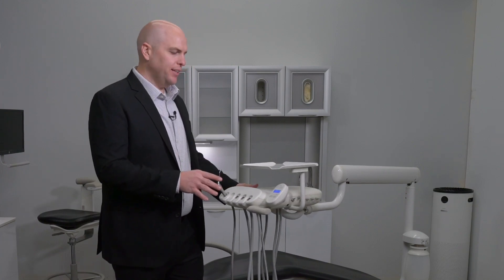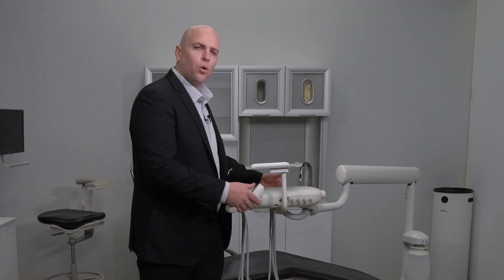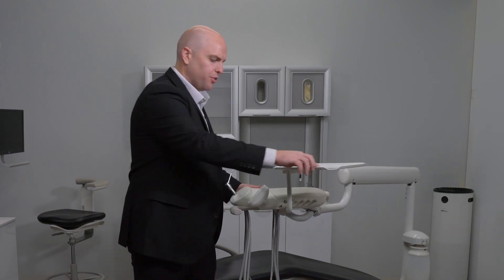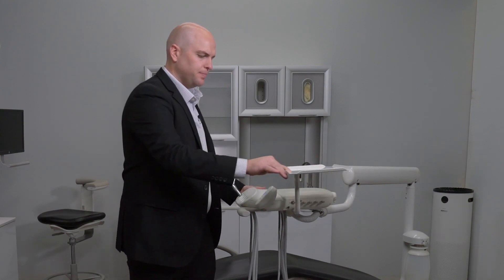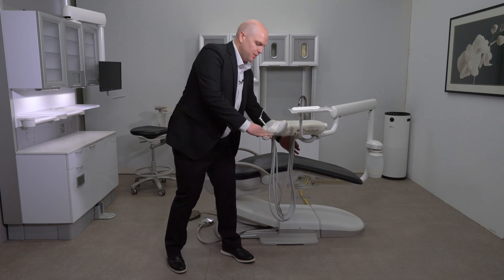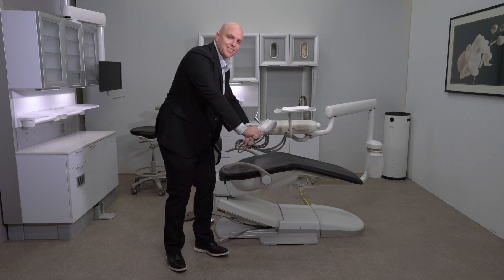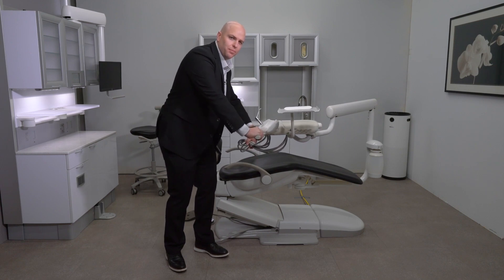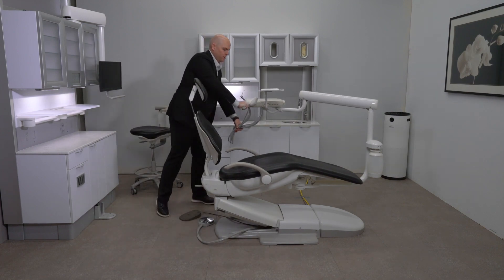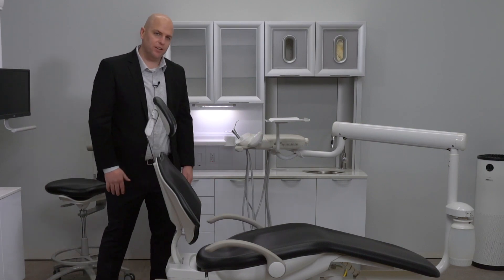Now that we've talked about the touchpad, let's talk about the tray holder. The tray holder can be mounted either on the right side or the left side of the unit, and will also rotate 360 degrees above the unit. To convert the delivery system for use by a left-handed user, simply collect the tubings in your hand to prevent them from getting tangled in the armrest, disengage the brake system, and slide the unit to the other side of the chair. Release the tubings and release the brake — now it can be used by a left-handed user.